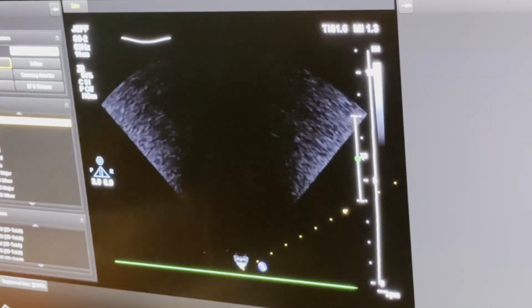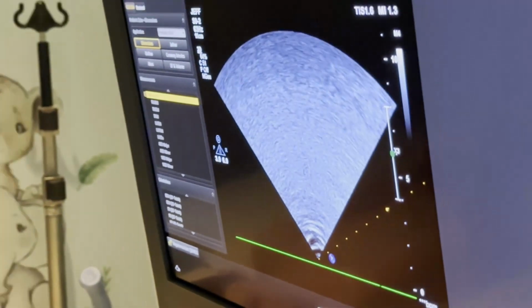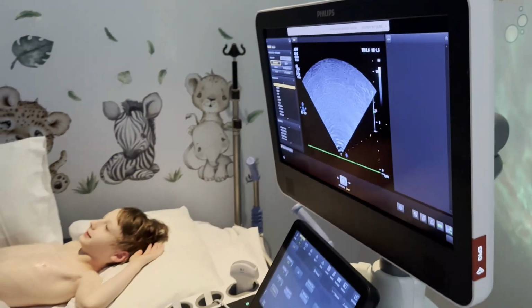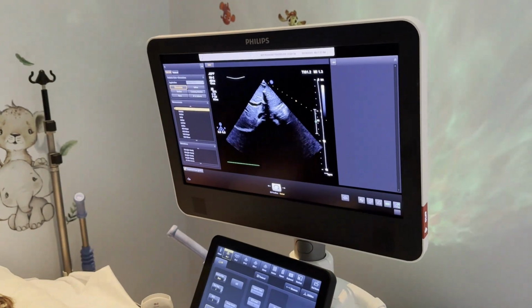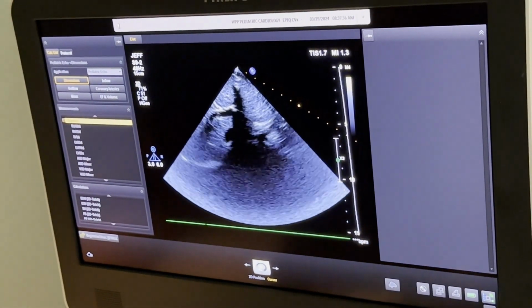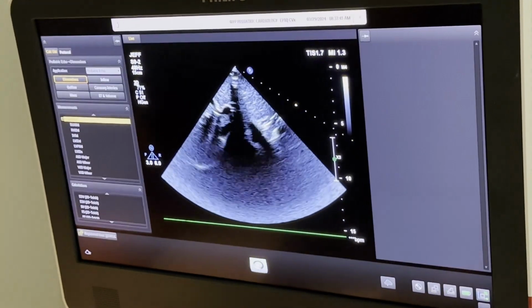All right, then we're going to move down to our subcostal images. All right, so you can lie on your back. There we go. Once again, we're going to get our reference view down here. And bear with me, all you adult folks, because we are going to turn this over. Sorry, very much a habit.